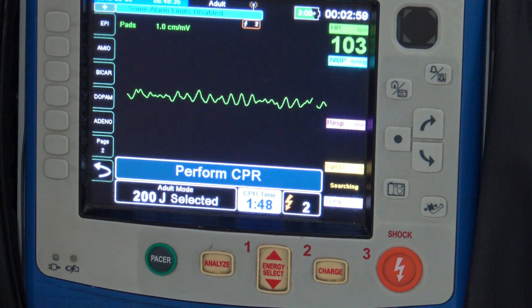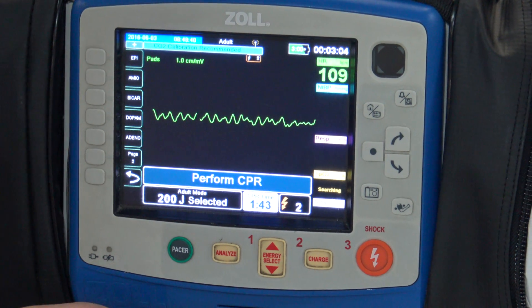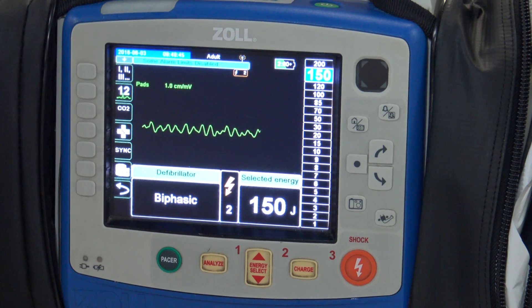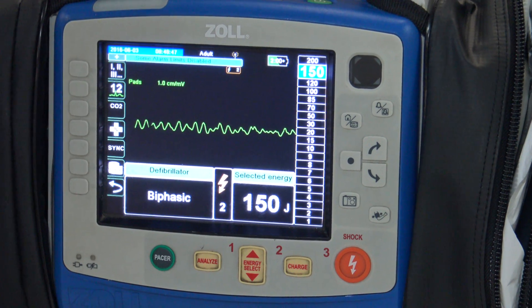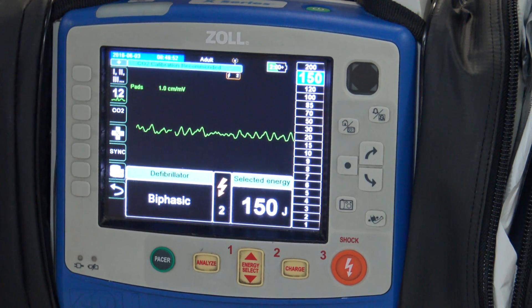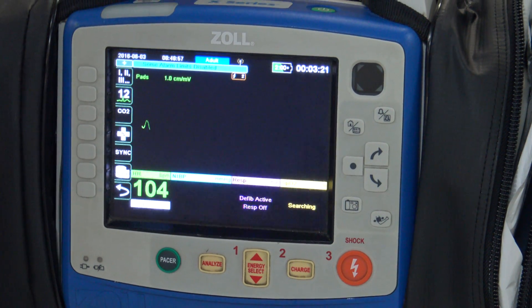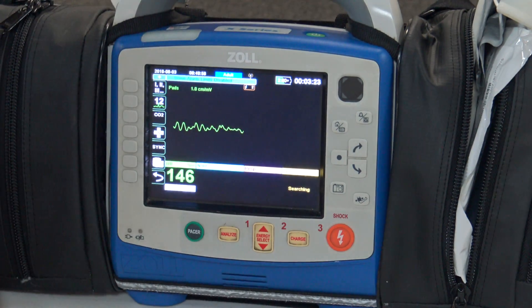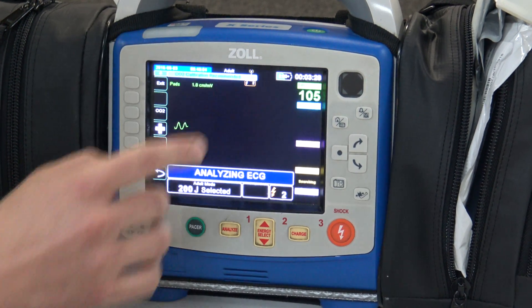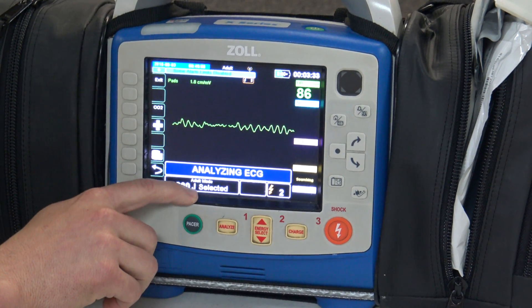If you want to get out of AED mode, or if you accidentally press energy select, it will take you out of AED mode back into manual mode. So pressing up on this is going to take me back to just my regular biphasic monitor. If there's a rhythm change and you want to change the energy amount rather than what the AED would give, that's something you can do. And if the person re-codes again, you can just press this button and it's going to take you back up to where you were joules-wise.